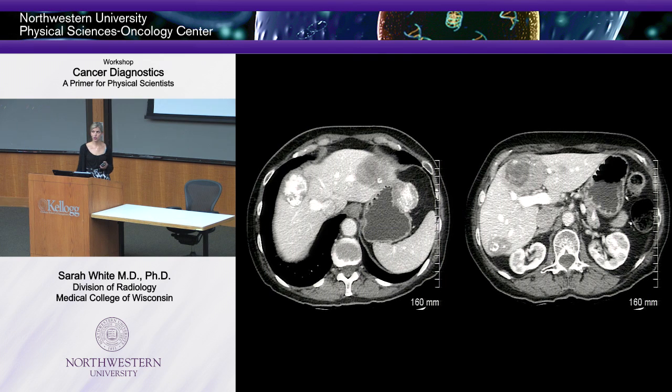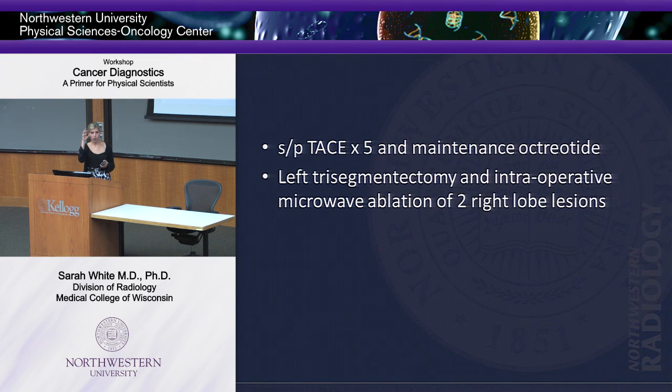And here she is. So the tumor starts shrinking. Okay, as the tumors shrink, we know we're getting good response. We actually got her down so much, 5 treatments she had to have. Okay, she came in, she got 5 therapies, but we got her tumors to shrink so much so that we could resect her liver. Okay, so the surgeons took her to the operating room, they took out part of her liver. And there were those 2 little pieces on that right side, they stuck a probe in the operating room, and they ablated that side. Cancer-free. So we thought, oh, this is a win. Okay, on imaging, we didn't see any cancer anywhere else. This is a win. We've cured this patient of cancer.